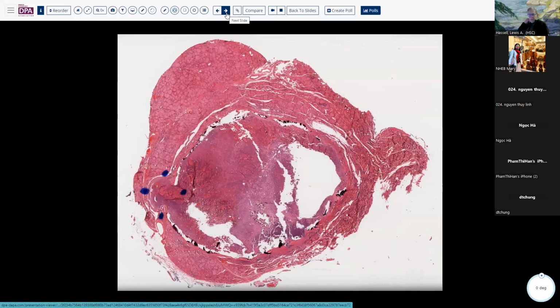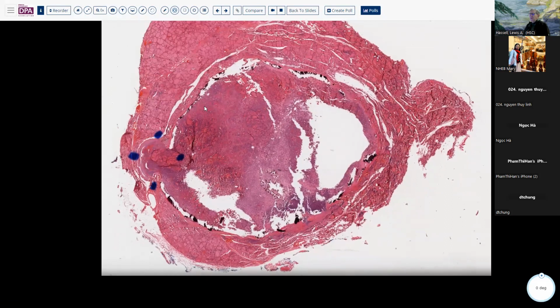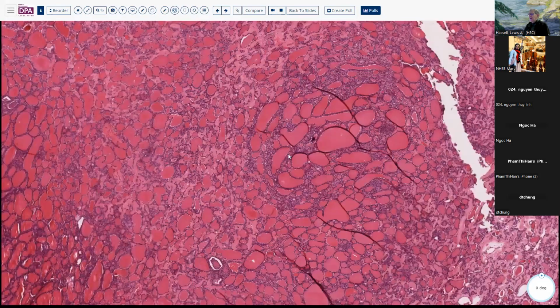So, of course, classic, well-differentiated thyroid tumors are more common. And I just include this for completeness' sake to illustrate true capsular penetration in a minimally invasive follicular carcinoma. Here we can see there's a follicular pattern.